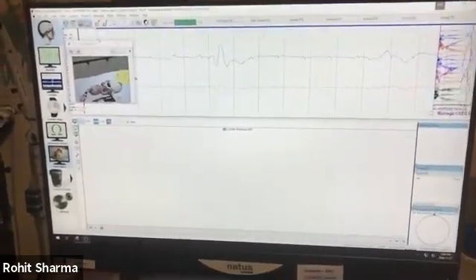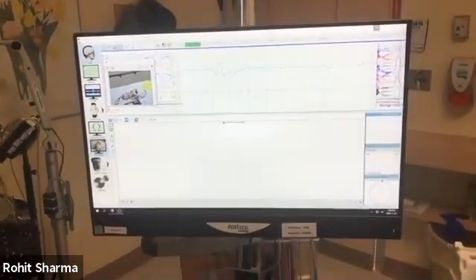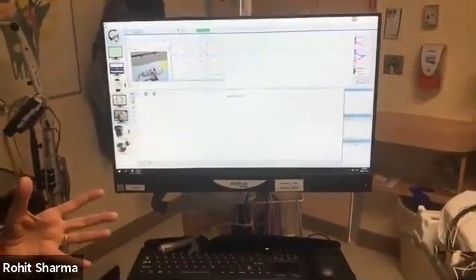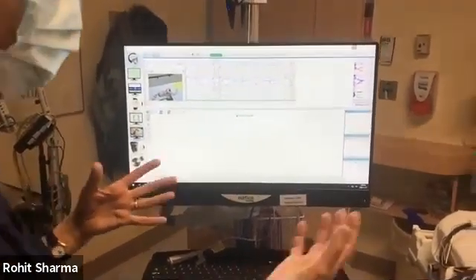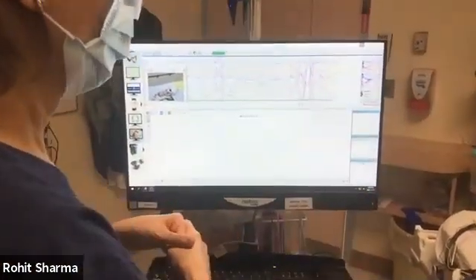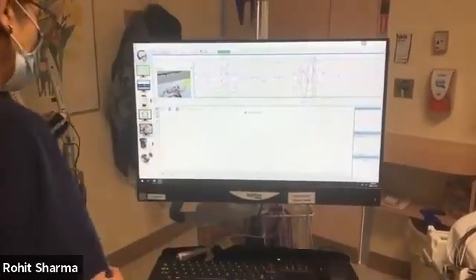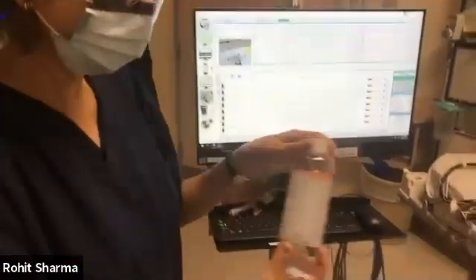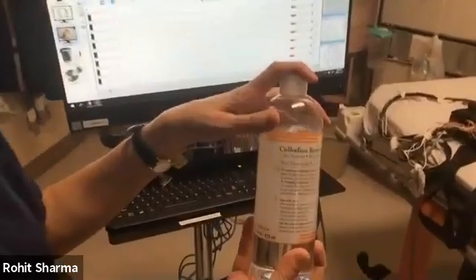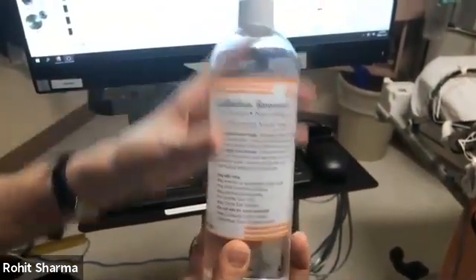The other thing we always like to talk about is how do you take the wires off the patient's head? Just in case the study is being done and you don't need the EEG recording anymore, you will shut down the study like I showed you before. And at the back of the machine, in the basket, we have a bottle of collodion remover. This is non-acetone and it's non-flammable remover.